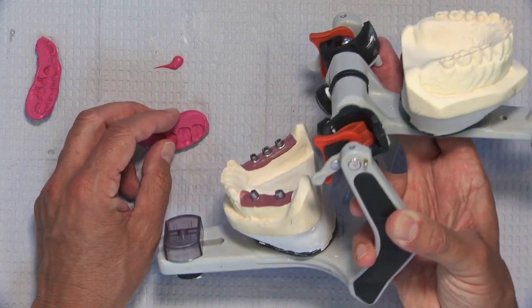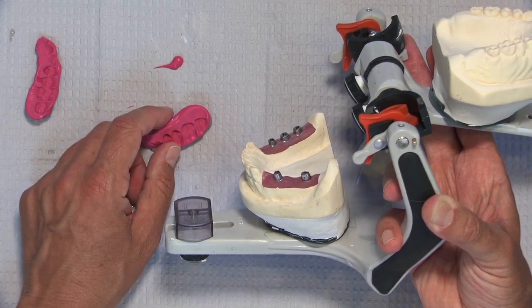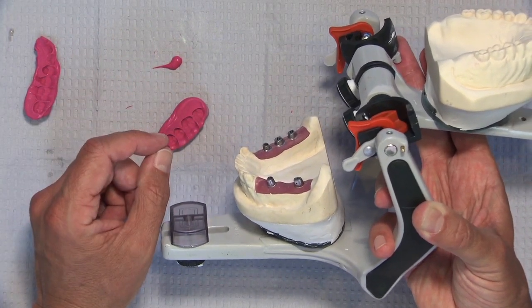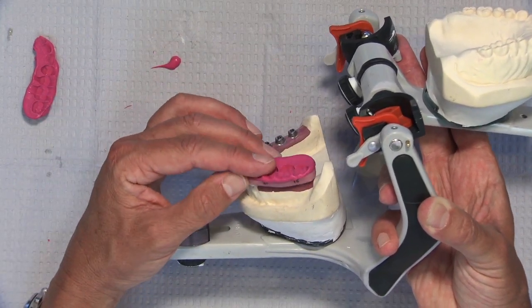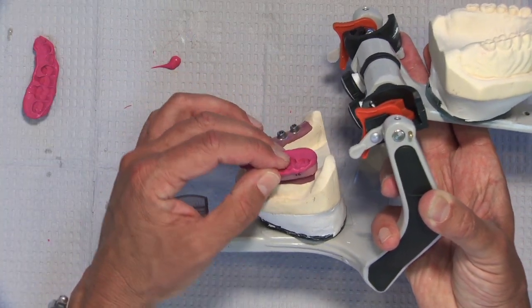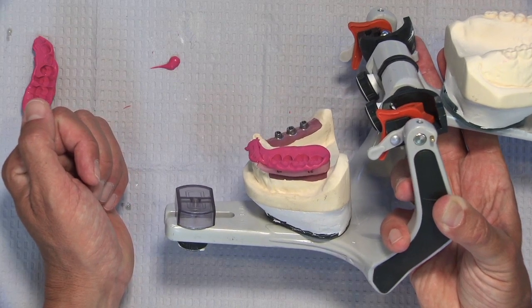And again, if you don't use custom abutments and you're doing this with a solid abutment or a stock abutment, an abutment replica, or what we sometimes in the lab call a single stage abutment, you can still do something like this. You'll just need to fashion a jig like this in your office to be able to get a stable platform here to put some bite registration on the other side and have the patient close down into.